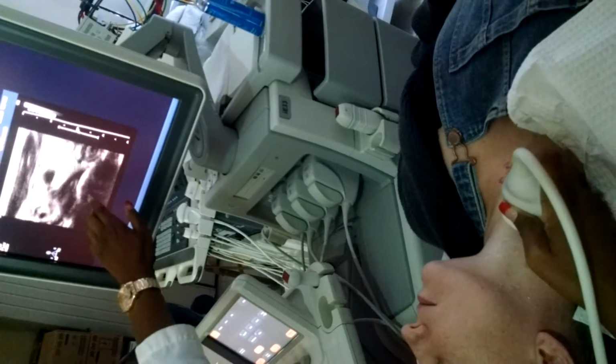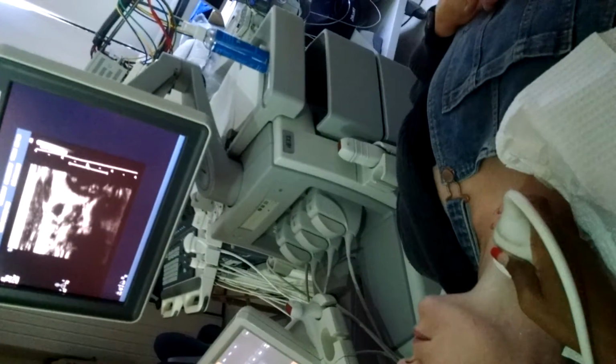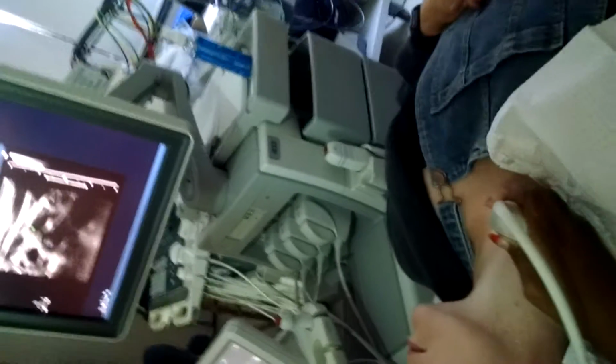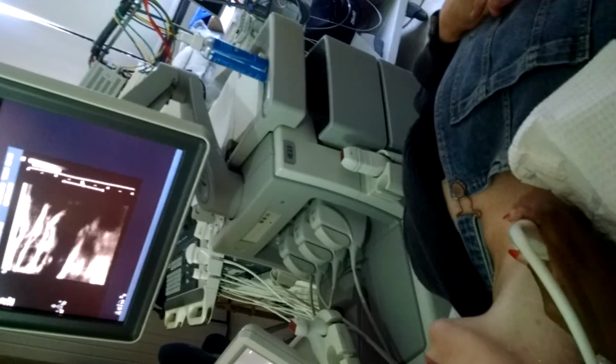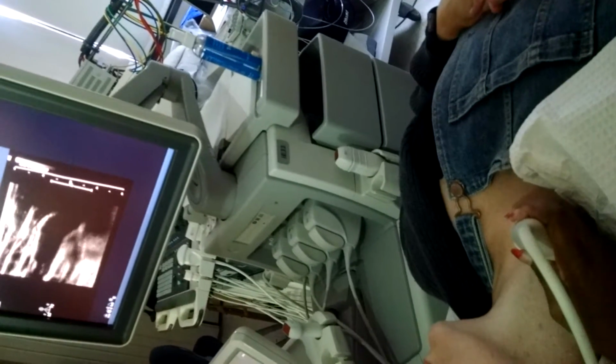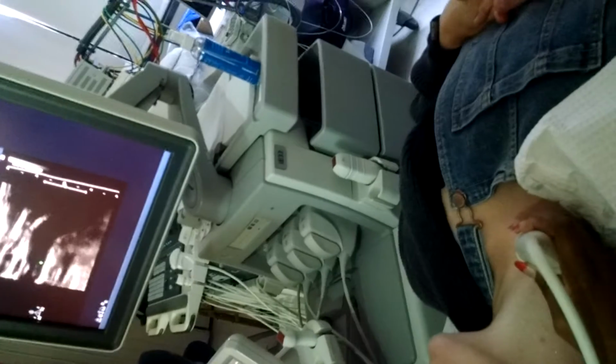Okay. Let me find the common. I follow the common. This is the common. I'm going towards the feet. Yeah, see how it's diving down? So that's the innominate, right there. The common carotid is going to shoot off that way, and the subclavian is going to come up right here.